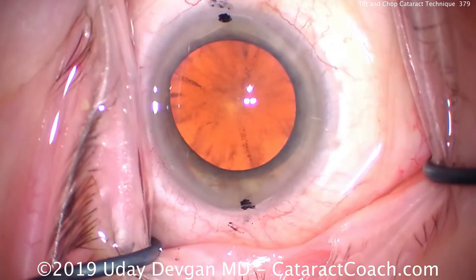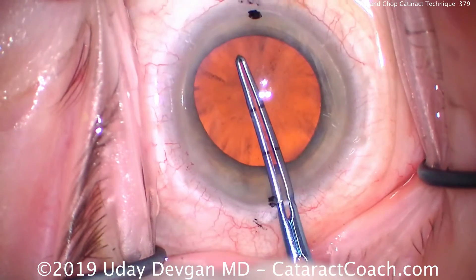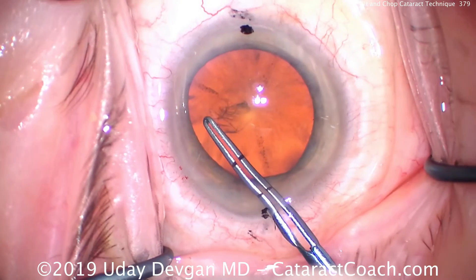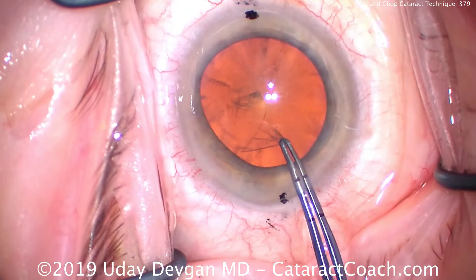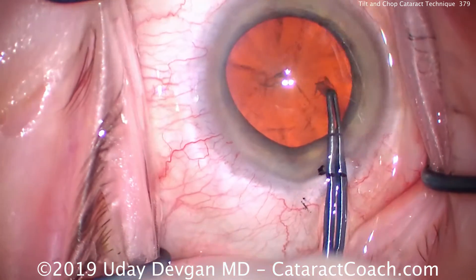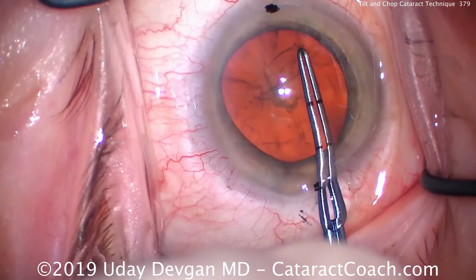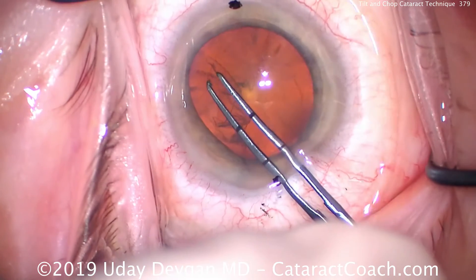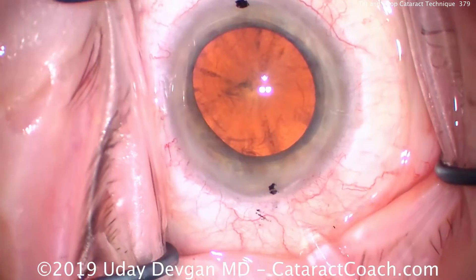In order to get the nucleus partially prolapsed out of the capsular bag, we have to make a sufficiently large capsulorhexis. We're aiming for about 5mm — 5 to 5.5mm would be just about perfect. If it's smaller than 5, it's going to be a little difficult to perform this maneuver. So make sure you have a decent sized capsulorhexis. You can see we're making it here, with nice pivoting, and that's going to be just about 5 to 5.5mm. It also has to be an intact capsulorhexis — it can't be radialized or weak at any point.